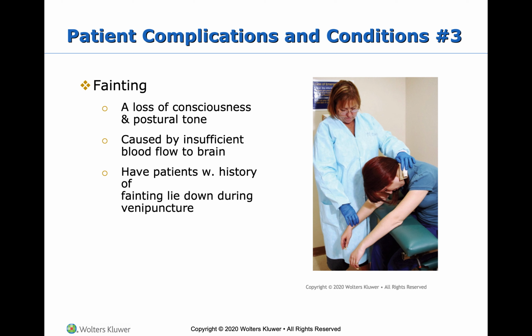They'll get clammy and sweaty almost. You can feel it on their skin. The biggest indication is they will get super pale. They might stop talking. So be alert and aware of these signs. Immediately discontinue the draw. Call for assistance. Prepare to catch them if they fall. Okay.